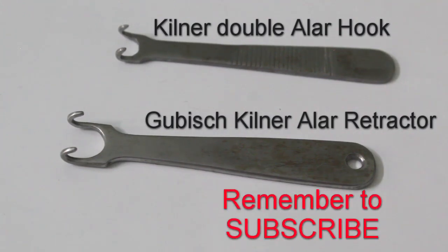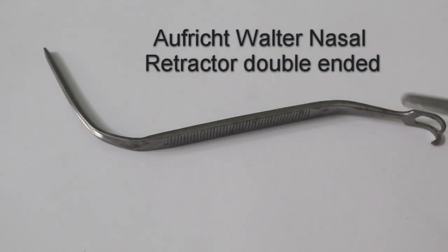These two instruments look similar but have small differences. This one is a Kilner hook cum alar retractor — you can see the tip is slightly blunt, making it protective. This other one is a small ala hook, used to retract skin and cartilage during dissection of the nasal ala. The tip of the small ala hook is much more pointed, so there is a chance of damage and you should be more careful. The Kilner hook cum alar retractor has a blunt tip.